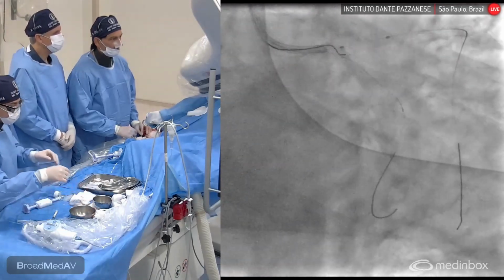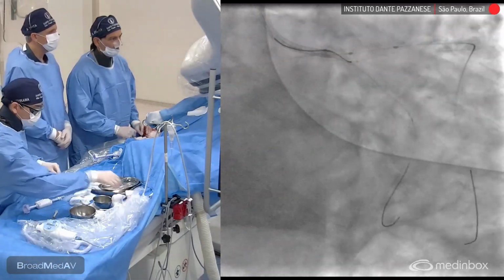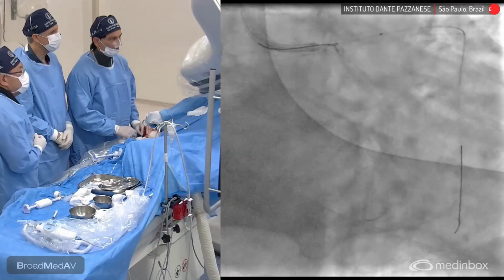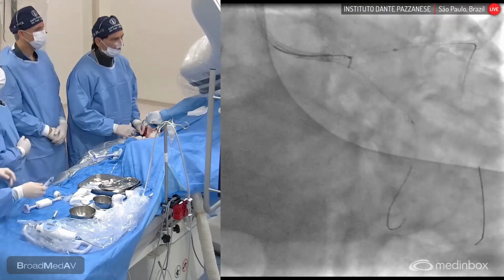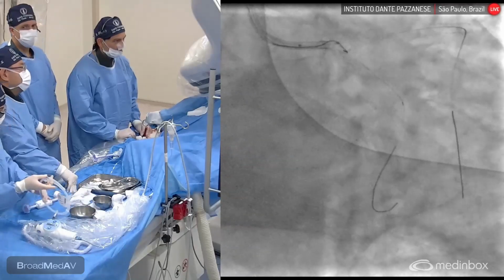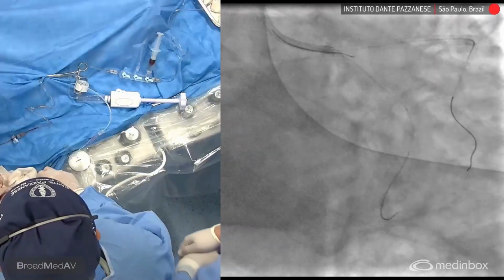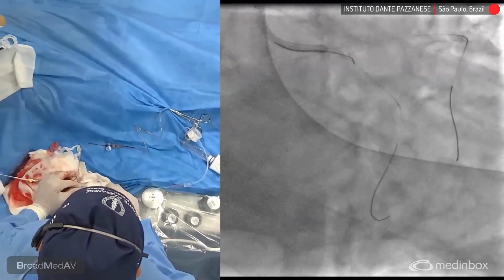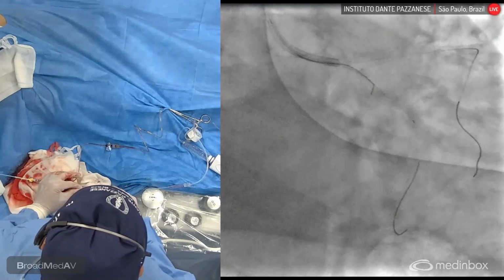So this is a Pilot 150, Rodolfo? Yeah. And you have a wire, you have a balloon in the LED, or maybe you want to remove the balloon, right? No, not the balloon. Okay, so Rodolfo is working here. Zoom in on his hands, please. That's a Pilot 50. No balloon there, so you can maneuver easier with your wires into the vessel, not competing with other devices.